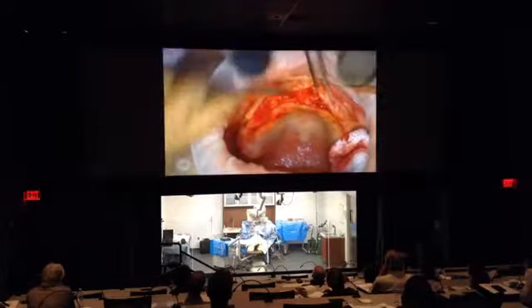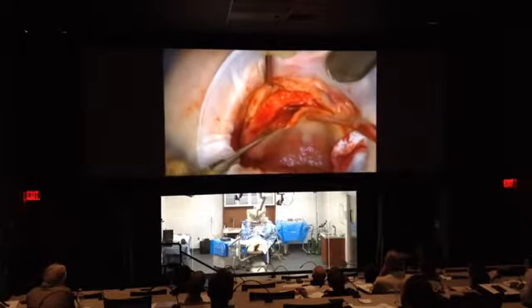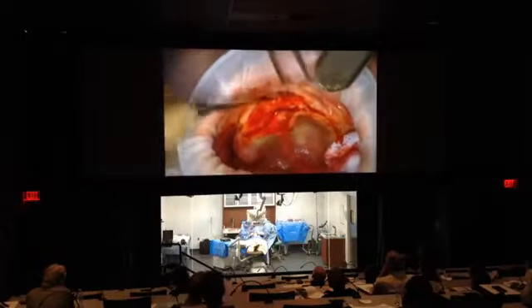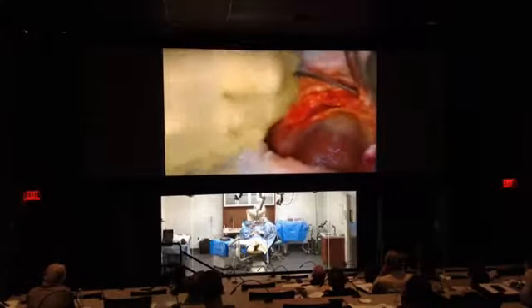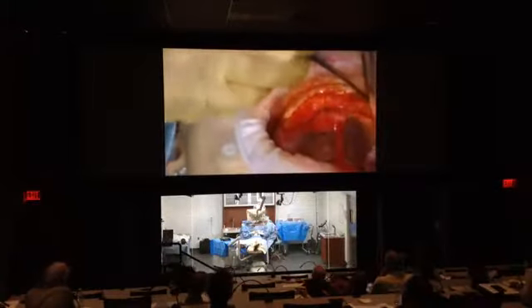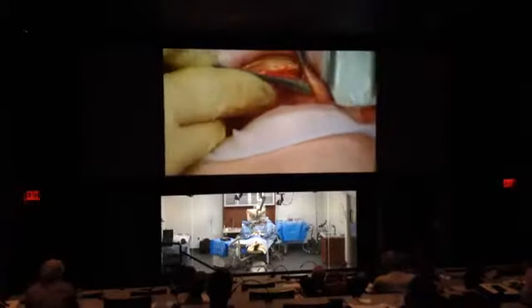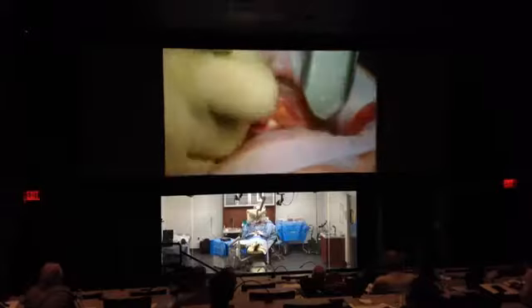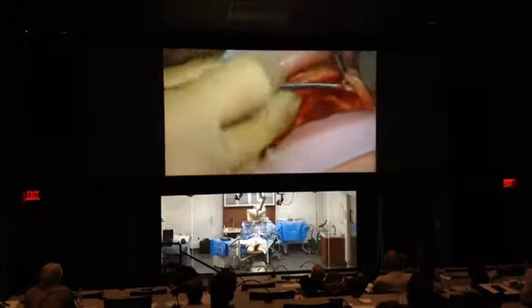Here we are, moving across to the other side. This side I like. I can see the ridge. You can see here good thickness. She hasn't lost too much bone in the last 2 years since she lost her teeth. But what happens, of course, if she would have carried this denture, I mean, she's 39 years old now, so if she would have had this denture for years and years, she would have completely lost this entire bone here. So a great advantage of doing this procedure now is to maintain the bone that we do have and the facial structures.